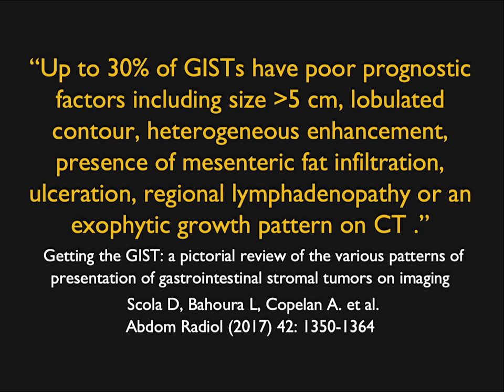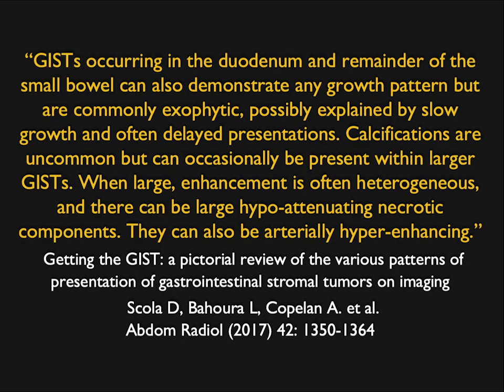Now, of course, the larger a tumor is, the more concerning it is. But I will admit, when you look at the pathology reports, even on the smaller tumors, the pathologists are very careful. They'll say, well, there's no malignant potential, but it could have a malignant potential, so you better watch it very carefully. Again, this idea about enhancement becomes very, very important.